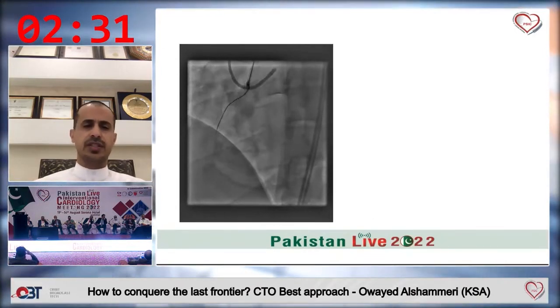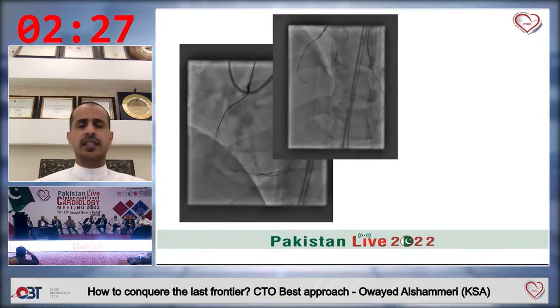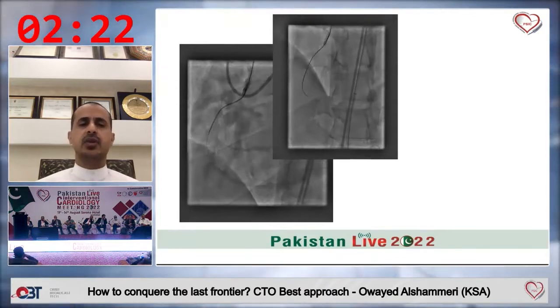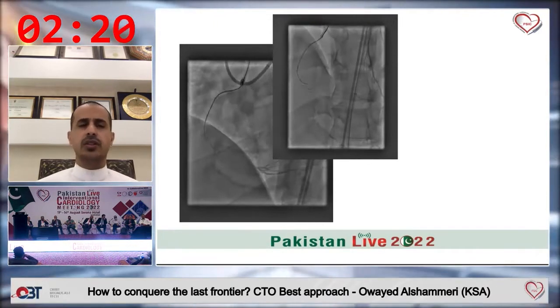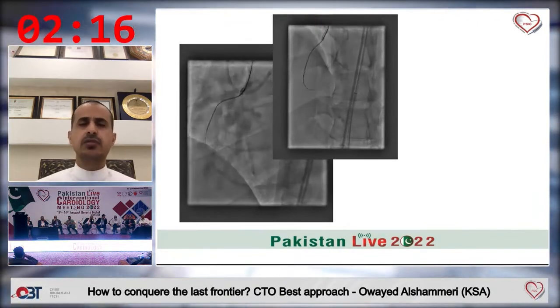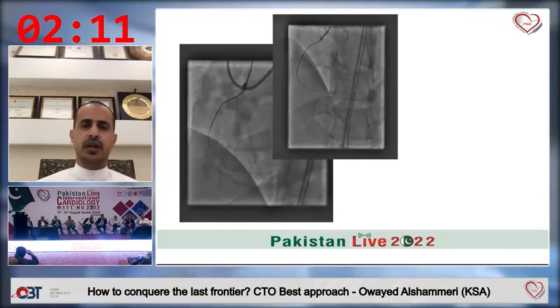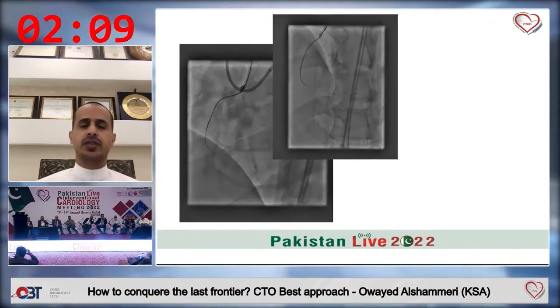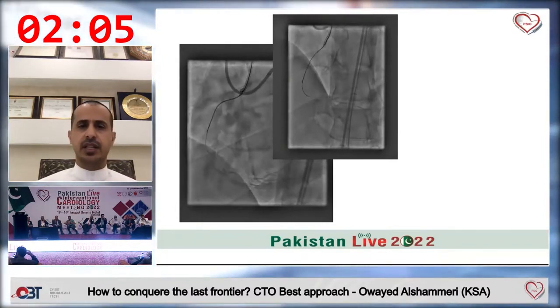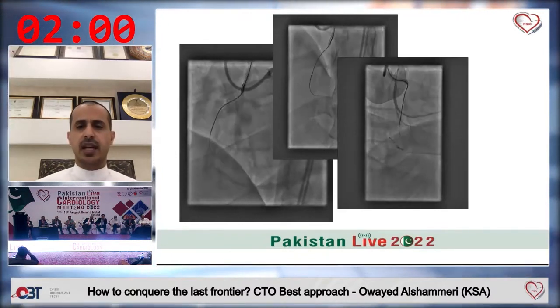For the sake of time, we just go to, as Omar was doing earlier, that he didn't allow time for the Pilot 50, just move on to the next one, which is Gaia Seconds. So giving a 2 minute time frame, probably or less, to test the guide wire instead of hammering the vessel with the same technique, just changing techniques. At that time, we decided to change the technique.